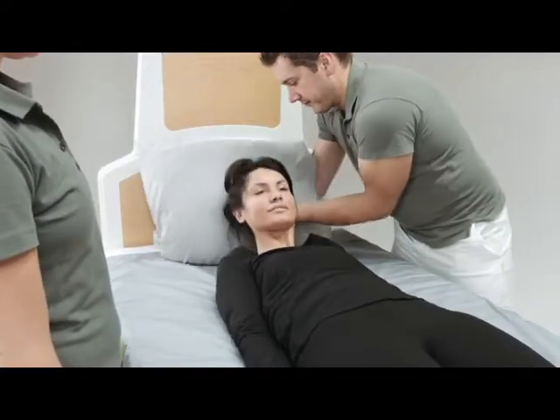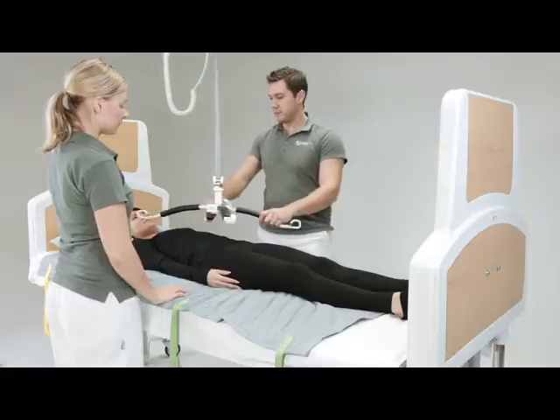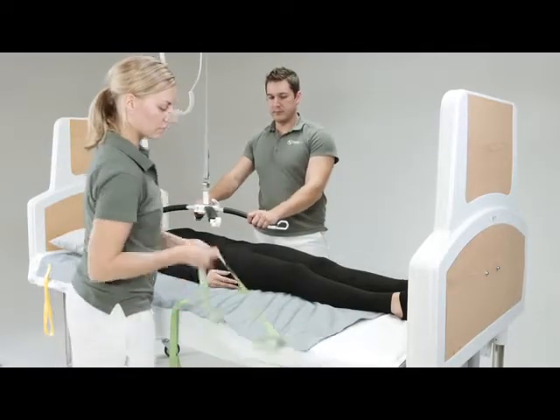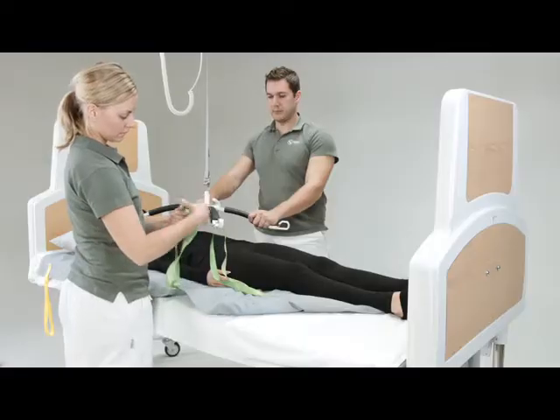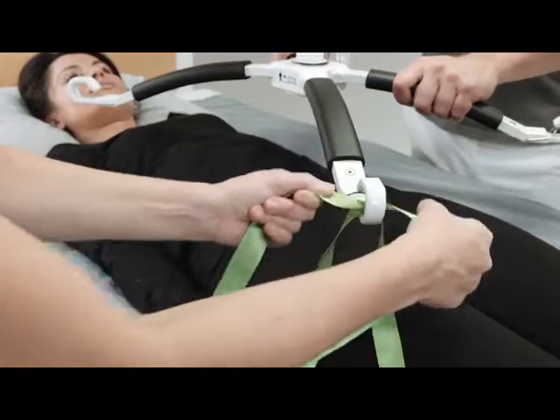When lifting with a 4-point hanger bar, make sure to orient the hanger bar so the longest width is head to toe and not across the shoulders. 2 loops will be attached to each of the 4 hooks.